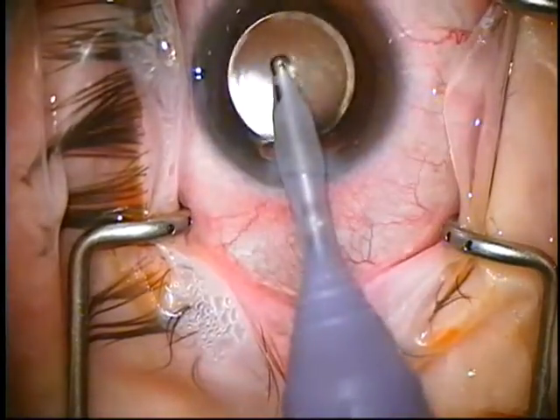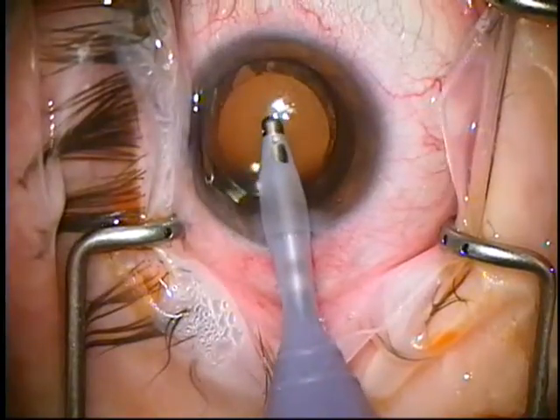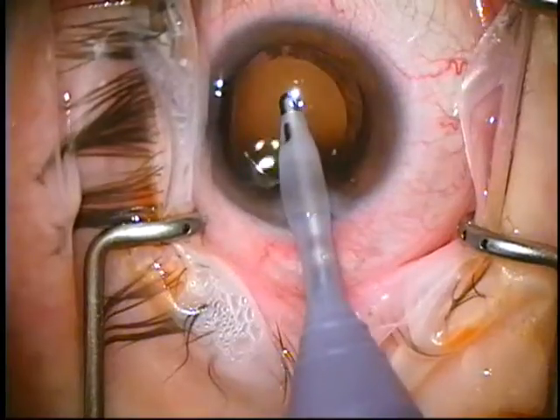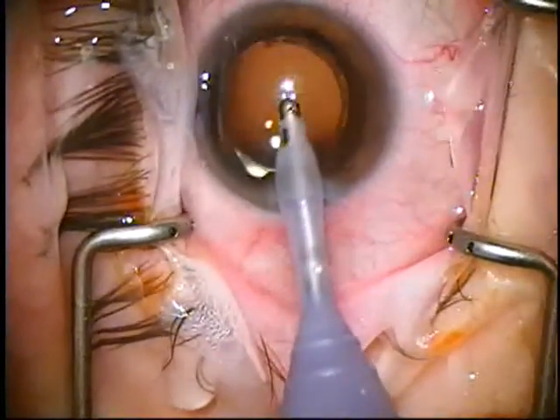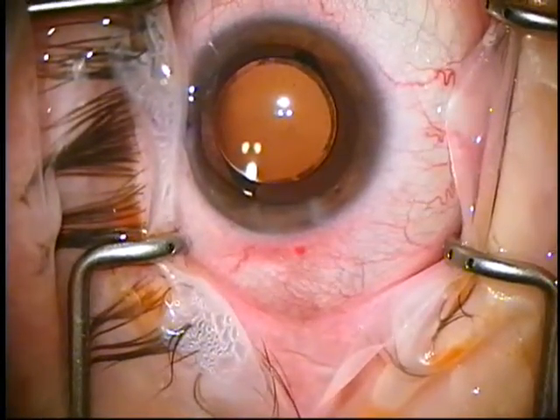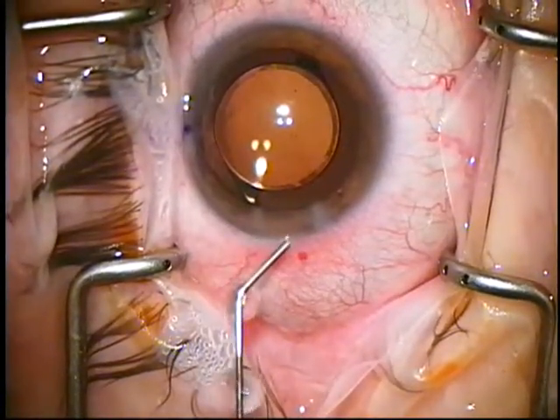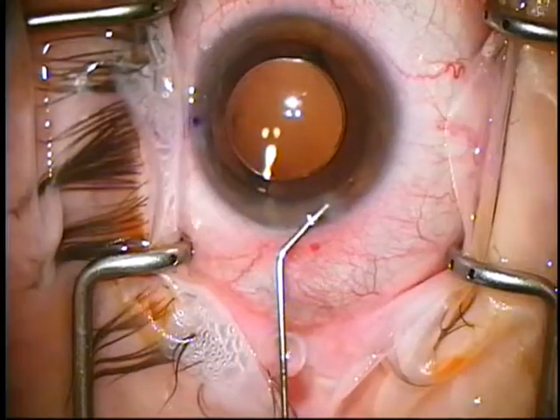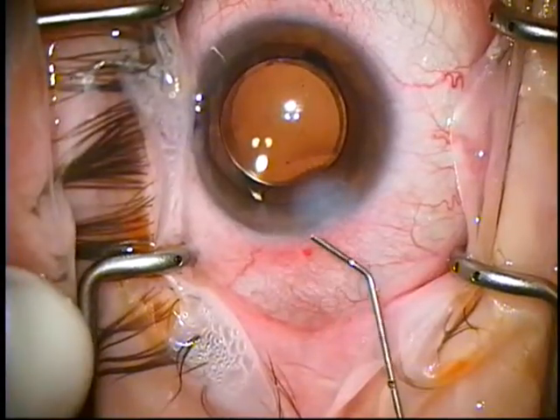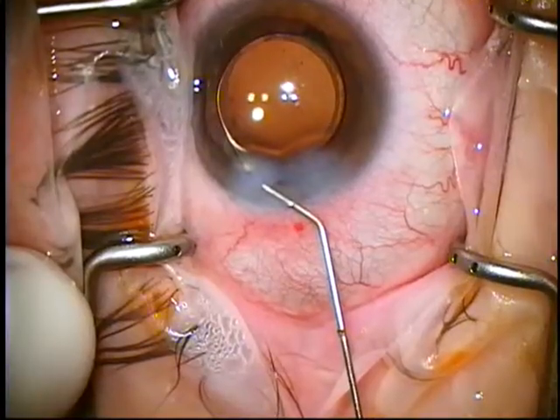She's got a lot in her AC — she's a myope, she has a deep AC. I tend to stay dead center and just turn my port side to side. Come out under irrigation, trying to keep the wound. To close the wound, you use an angled 27-gauge. Try to sneak through so you don't dump fluid out of the AC, so you're not pushing posteriorly at all. You can see some subtle posterior movement there with dumping of the AC, but not much.